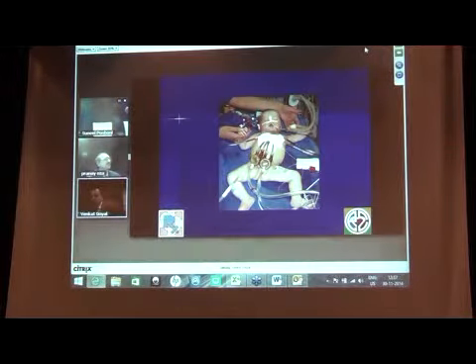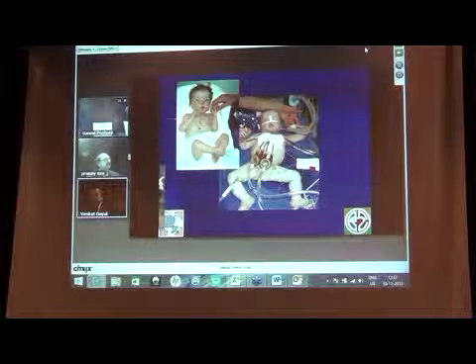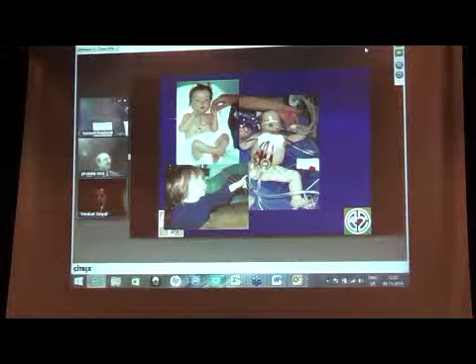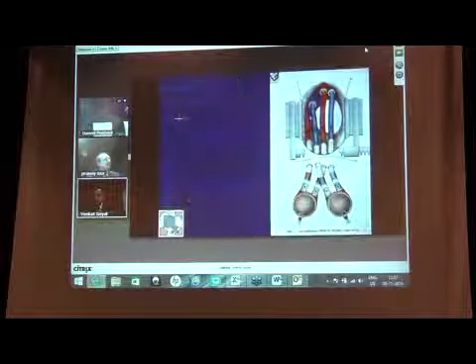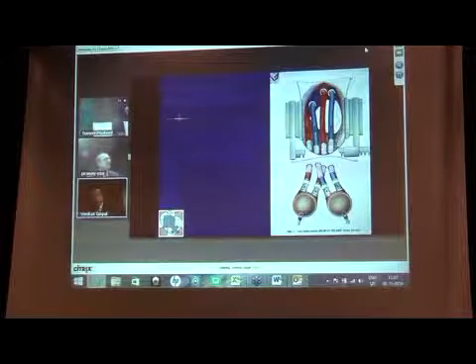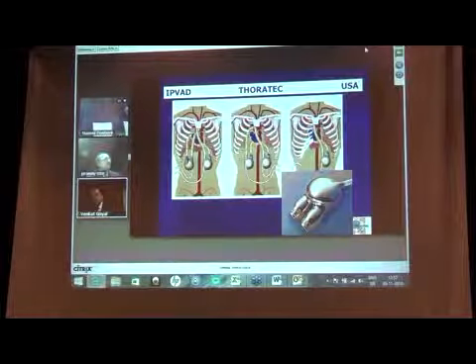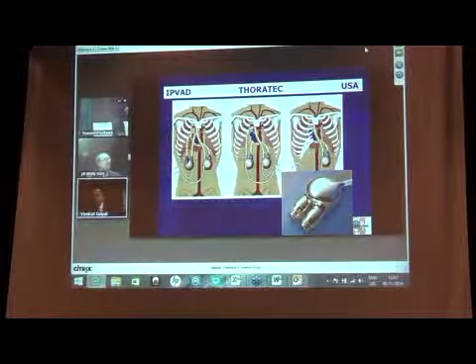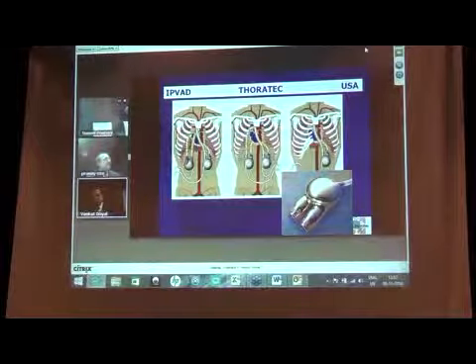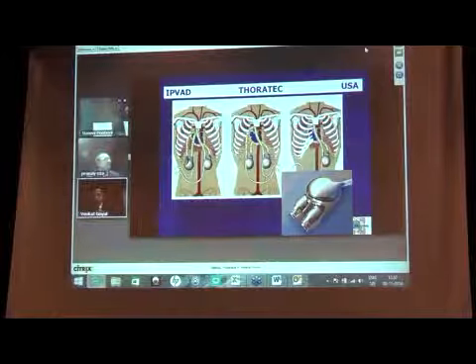This is the biventricular extracorporeal pneumatic assist device, for right ventricle and left ventricular support. After the patient improved out of myocarditis, the patient is like this. These are a few examples of similar cases. This is extracorporeal cannulation of a biventricular assist device. Then as things progressed from pneumatic to electrical systems, they were connected by a cable outside to an electrical system or a battery system to support the pump, and the pump became an intracorporeal biventricular support.